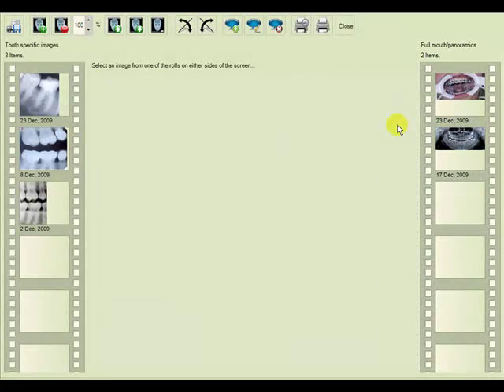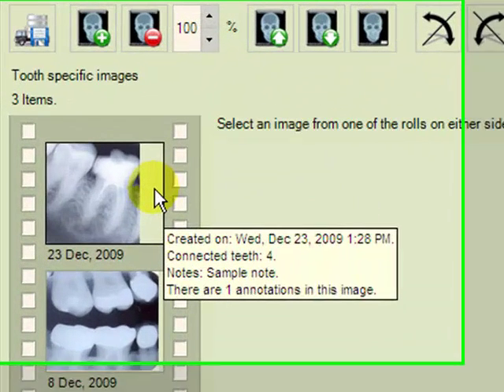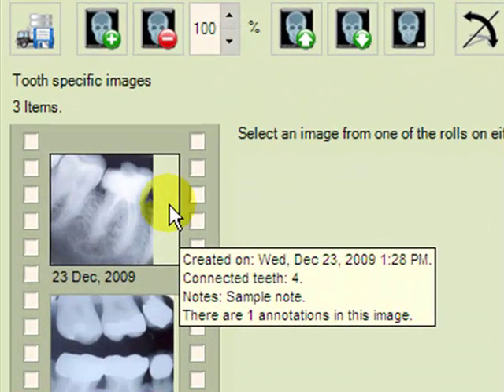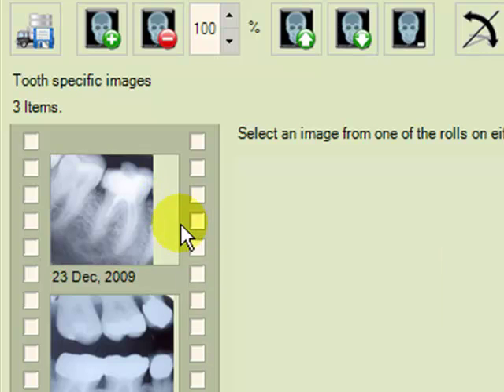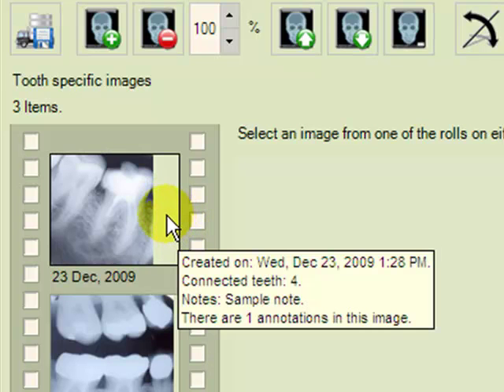If you hover your cursor over an image, you will see displayed the properties of that image, such as the creation date, what tooth it's connected to, any notes, and if there are any annotations.